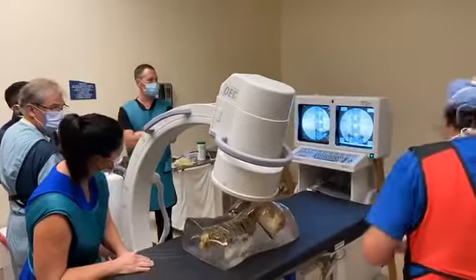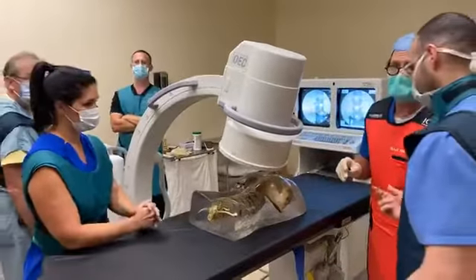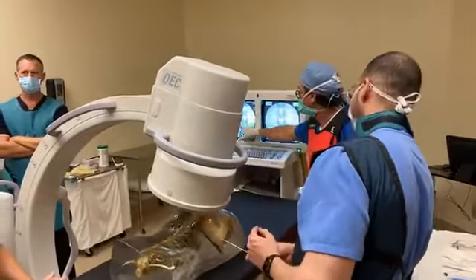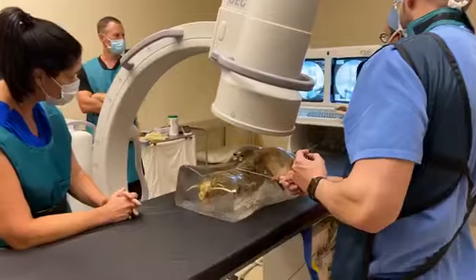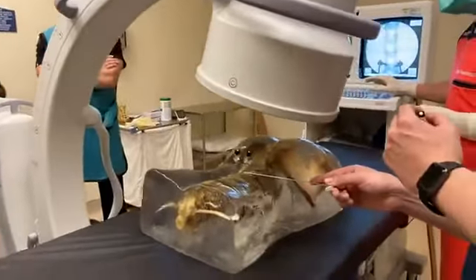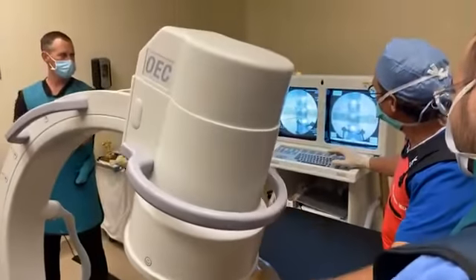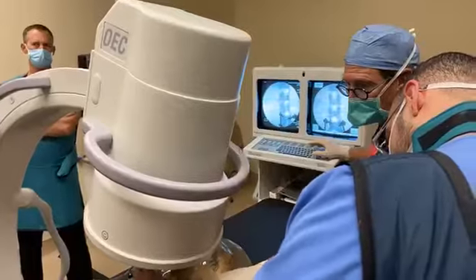So let's get Arash in here. Arash is our medical student, and we're going to do a transforaminal epidural. So we're going to go underneath the pedicle. Let's come south. Right about right there. You just stick the needle, follow the beam, okay?